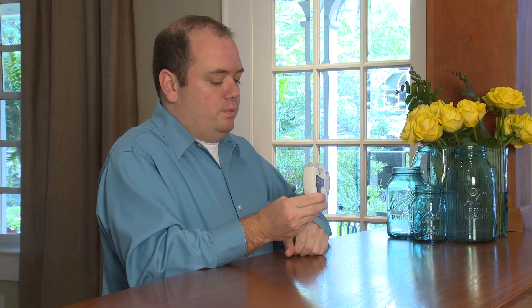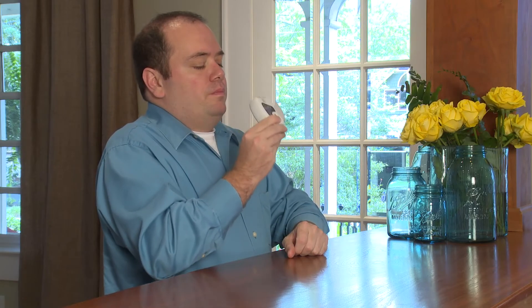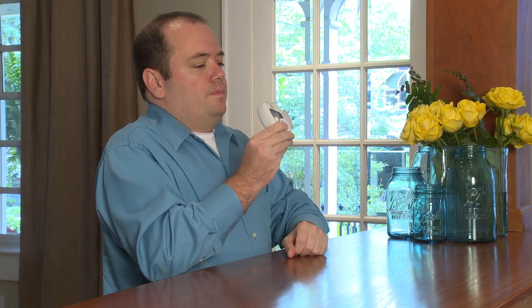When you're ready to begin your treatment, blow all the air out of your lungs slowly. Next, place the Ellipta mouthpiece in your mouth and seal it with your lips. While sitting up, hold the Ellipta and take a slow deep breath through your mouth.